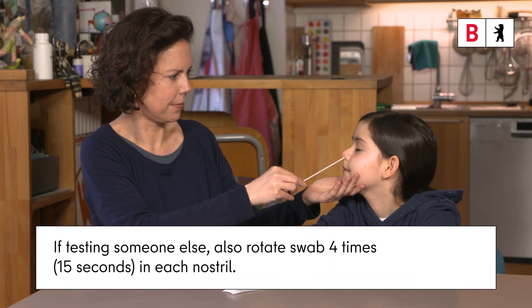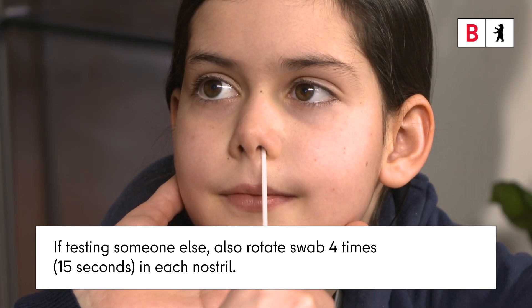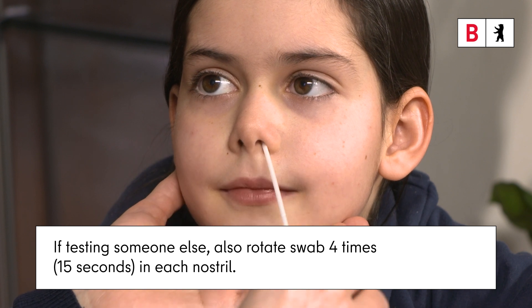If you are being tested by someone else, or testing someone else, still turn the nasal swab 4 times for 15 seconds in each nostril.